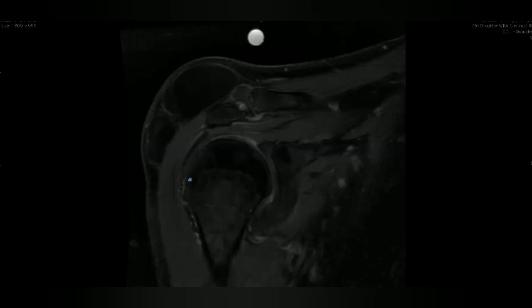What will help you differentiate between a lipoma and a liposarcoma? Size. Size can help you differentiate, but size is not the only predictor. Is it well marginated or not, and also the symptoms of the patient, its septations. Septations, sir. No. The only thing that can help you differentiate between ALT and atypical lipomatous tumour.